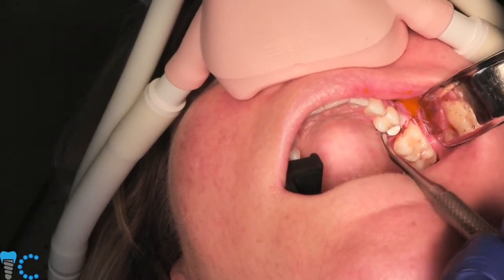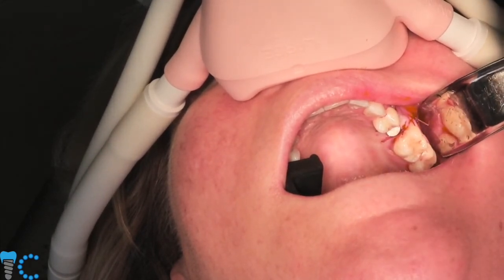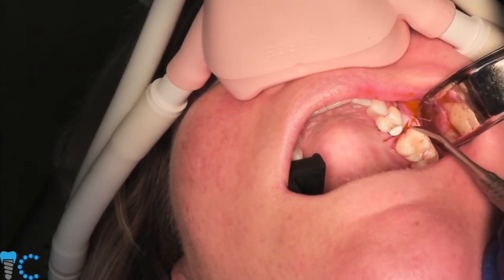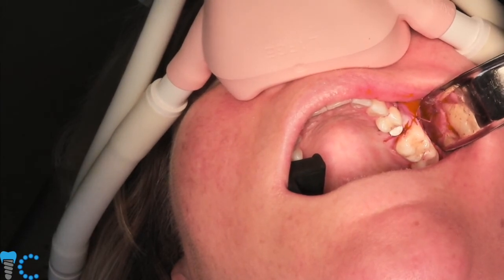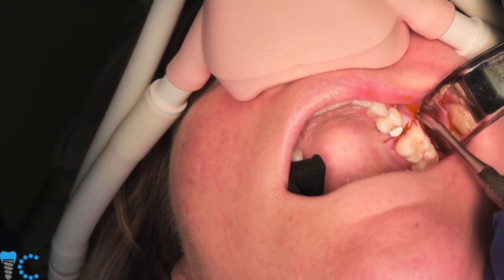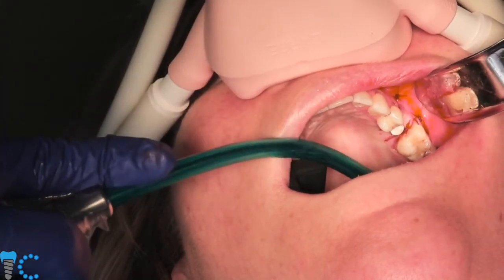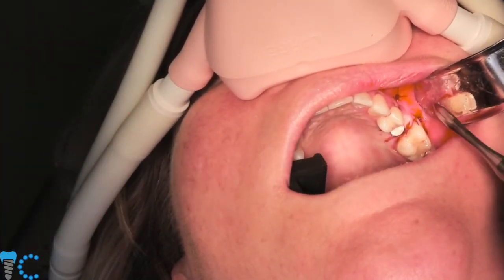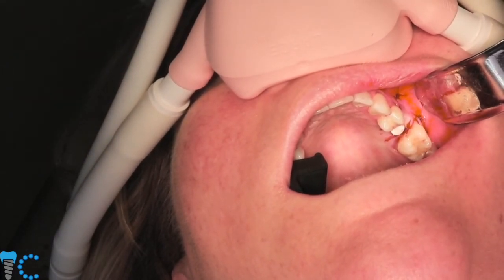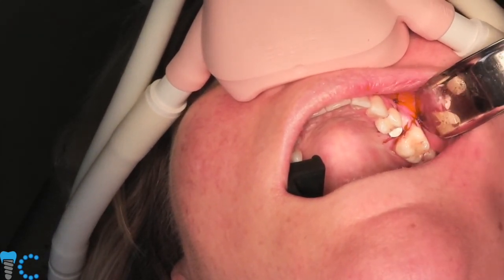By making our incision a little bit to the palatal, it does make suturing a little bit more difficult. It definitely does make those two sutures a little bit more complicated. But in the end, the result is we have this beautiful attached tissue. So when she's brushing her crown down the road, she has tissue that's going to resist that. Then we put two sutures up a little bit higher to close the limbs of our releasing incision. And I think it's clear that our incision is wider at its base than it is at its top, and that we didn't cross over adjacent tooth roots. So pretty good basic surgery.